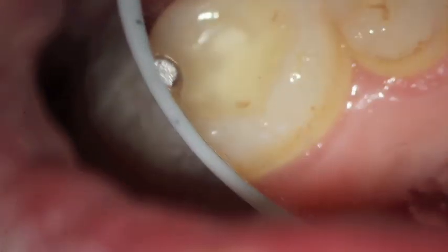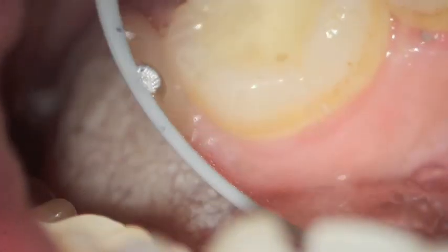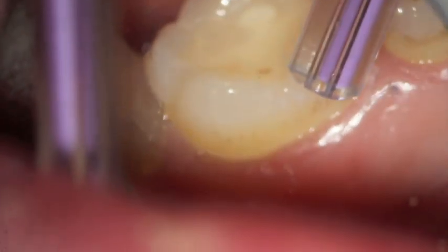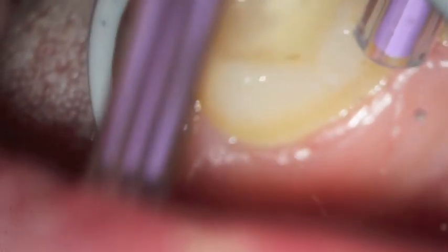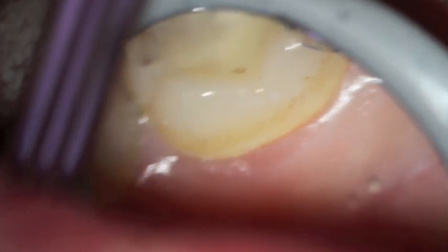This is something that will probably take multiple visits, and he has tartar caught underneath the gum tissue. And in order to see it on the x-ray, which in this case he has, there's quite a lot there. Sometimes people will need to be numbed up for that, even though they haven't any bone loss.